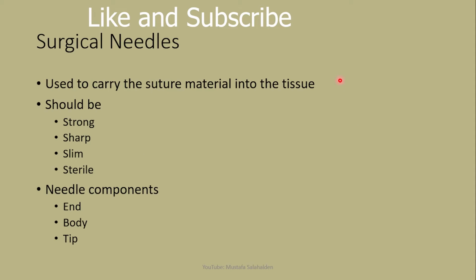Surgical needles are used to carry the suture material into the tissue, and they should be strong so they do not break during suturing, and sharp so they penetrate tissues easily, and slim so they cause a smaller hole in the tissue and minimal tissue trauma, and sterile so they do not cause infection to the tissue. And the needle components are the needle end, needle body, and needle tip.